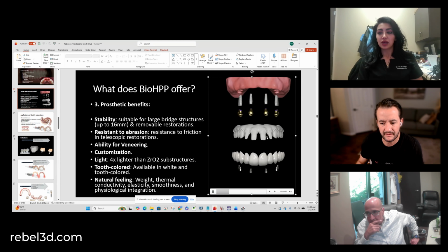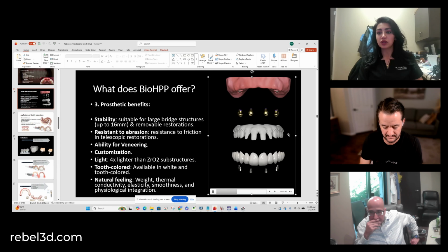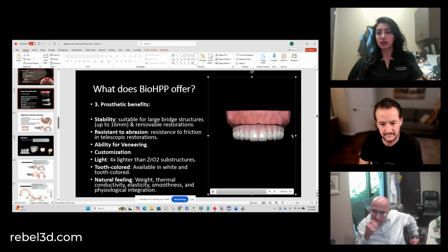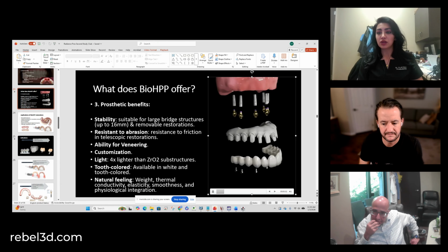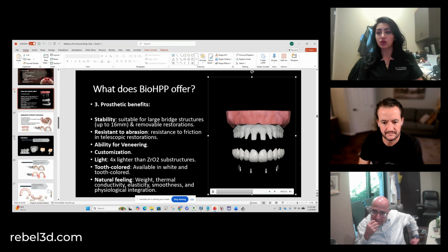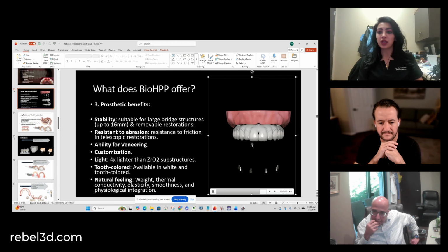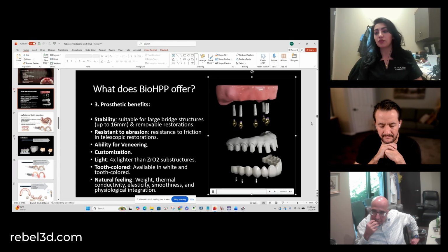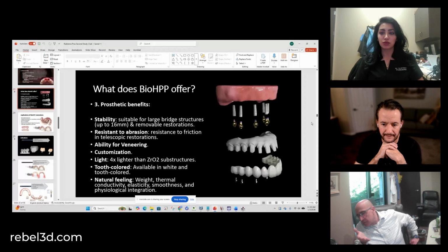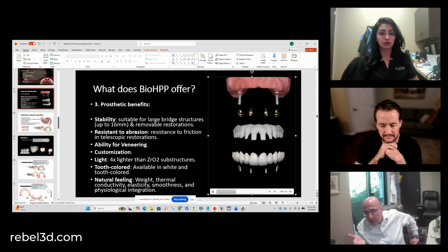Yeah, so basically here it's a thimble design, BioHPP bar, but you can also design it as an eye bar with zirconia sleeve. This design allows for ease of maintenance in the future. In case the patient breaks one or two crowns, you can just replace that one segment, because you can do it in 3 to 4 segments, zirconia bridges cemented on top of that thimble design. Full control of the gum color if you want to do it. It can be relined in the future if the patient, for whatever reason, lost some bone.